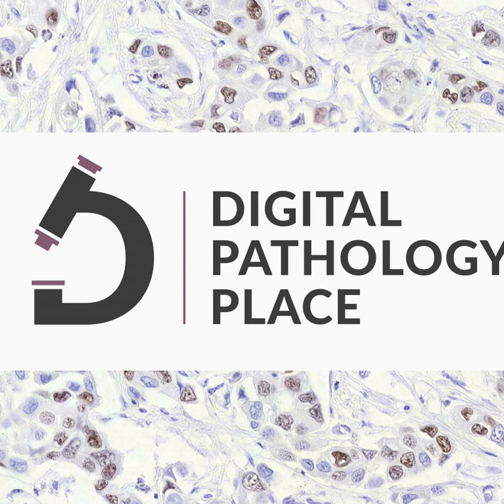If anybody knows exactly, I can Google it later, but I think Part 11 is for computerized systems, Part 58 is for non-clinical work. But there is a GLP regulation for computerized systems, and it's written exactly what you do with a computerized system. So you take this digital pathology system, you say, oh, it's a computerized system. What are the components of the computerized system? It's this, that, scanner, viewer, whatever, uploading of slides, and you validate them. So yeah, no surprise there.